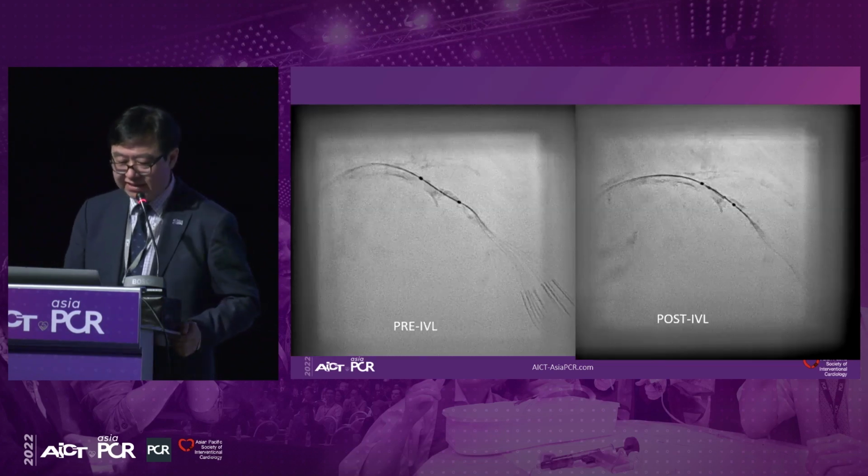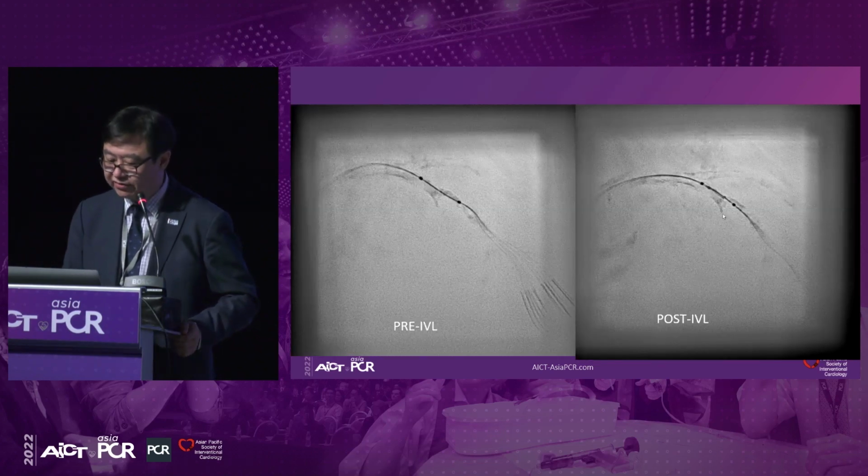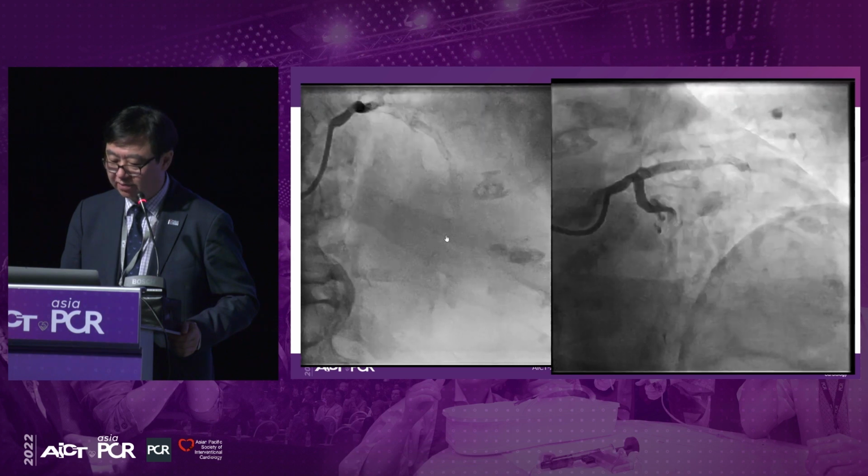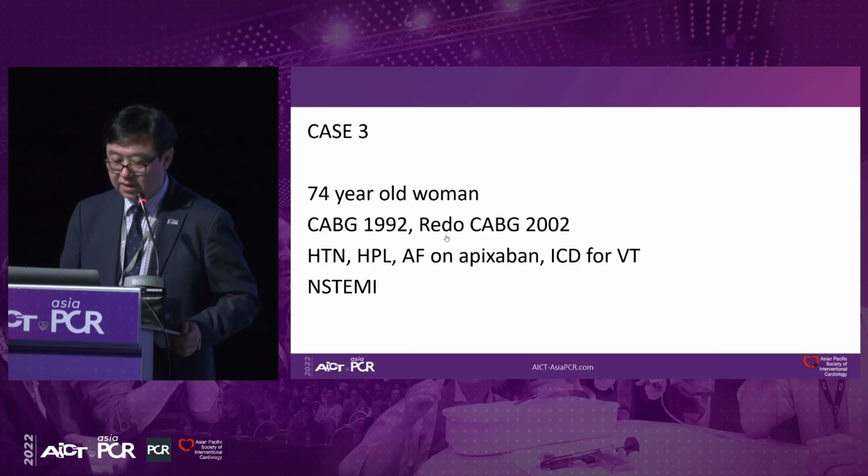We actually used an NC balloon. This is the clear stent pre and post lithotripsy, noticing the disruption of calcified shelves. Stenting procedure was optimized. We're very happy. I won't show you the last one.